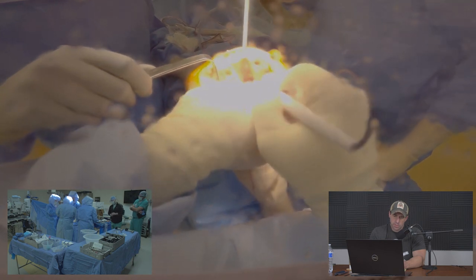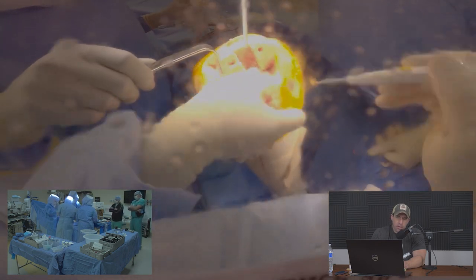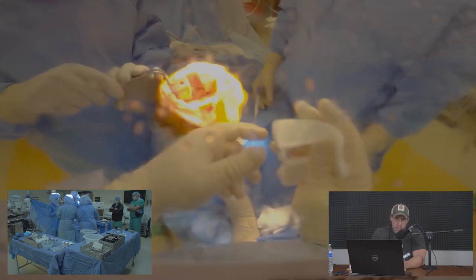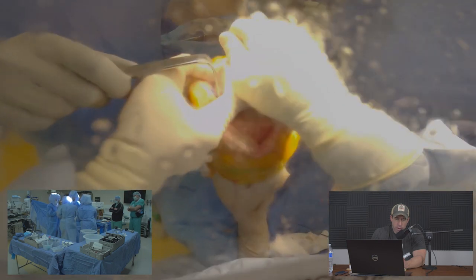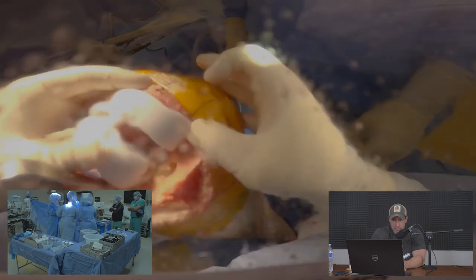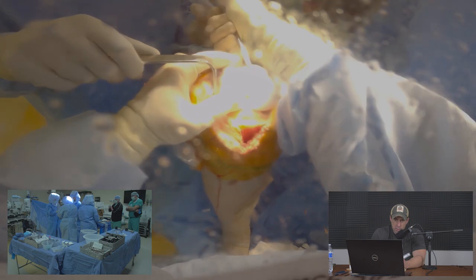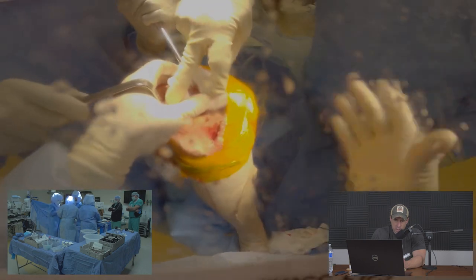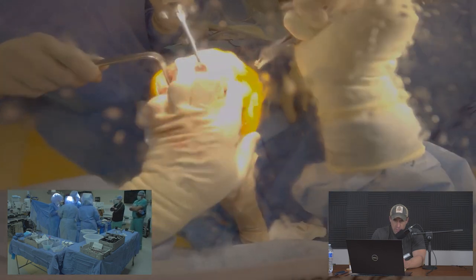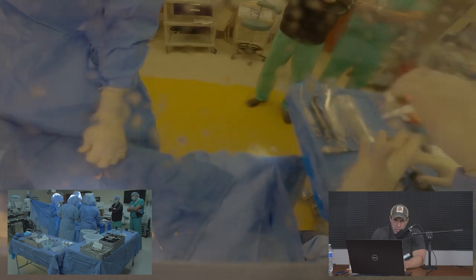We clean up soft tissue remnants and release tight posterior capsular tissue that could block full extension — this patient had a flexion contracture. This is a trial femoral implant, a disposable 3D printed piece, and it's fully customized. Using a bone hook to expose the back of the knee, I carefully check for bone spurs potentially overhanging the implant along the sides and posteriorly.